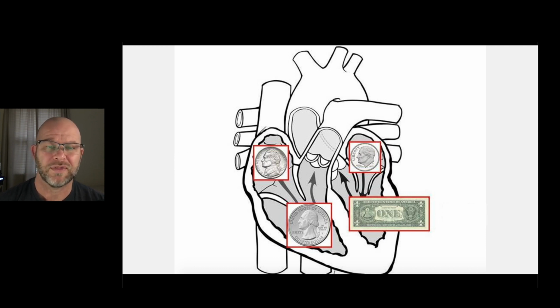One of the things that you want to collect in a right heart cath are the pressures inside of the different chambers of the heart. So usually you're collecting pressures and you're collecting oxygen sats. When you think about the right atrium, as a former firefighter, when I think of fire pump terms, your right atrium has three intakes. It has from above the heart, the superior vena cava, from below the heart, the inferior vena cava, and one more, the coronary sinus. That's where the blood that fed the heart muscle itself comes back to the right atrium.